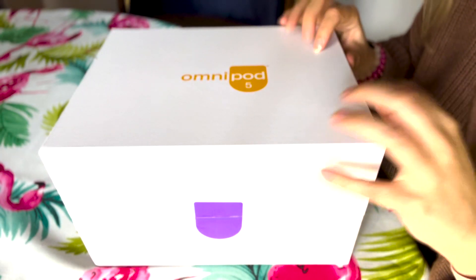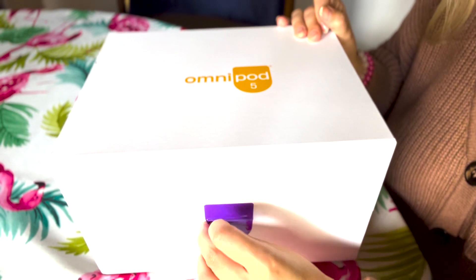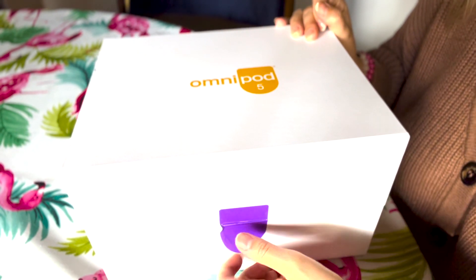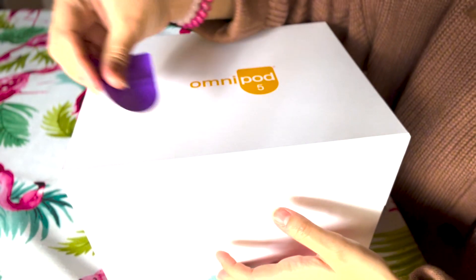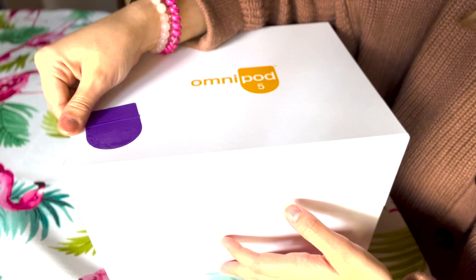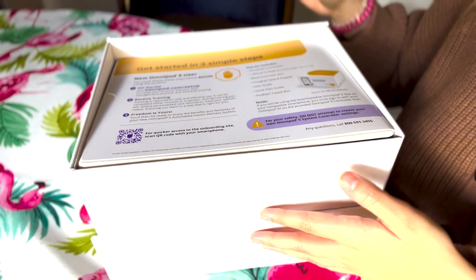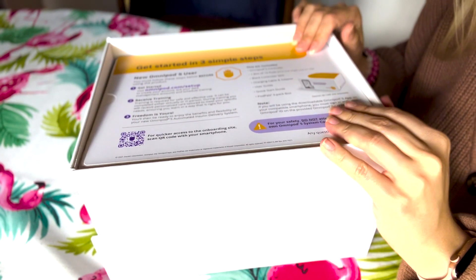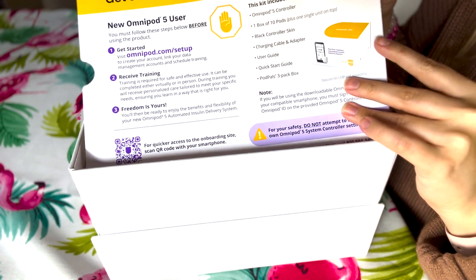They send you this nice box, and you must get Omnipod 5 through a pharmacy benefit. This likely means you may have to go through some insurance hoops, because typically insulin pumps are not covered through pharmacy benefit. This will likely require a prior authorization — your doctor's office will need to fill out forms for your insurance to confirm you need insulin pump therapy. It is typically covered for type 1 diabetes, and some plans cover it for type 2 or other situations.